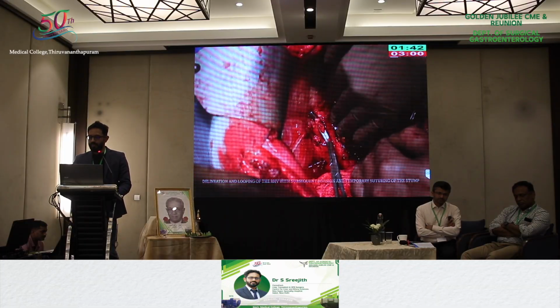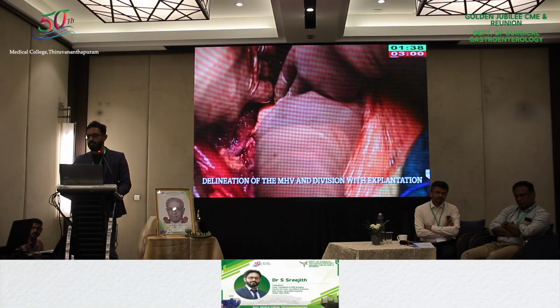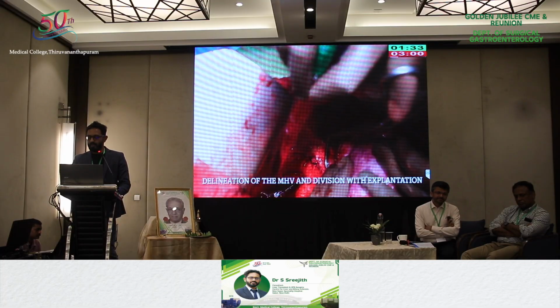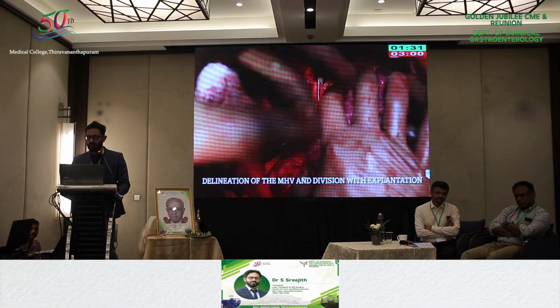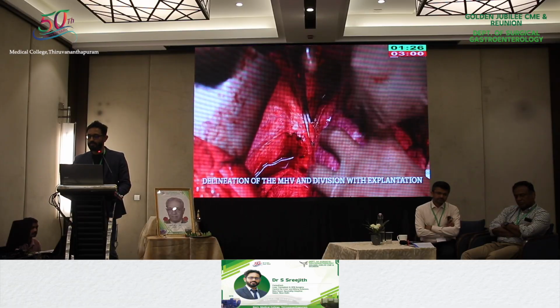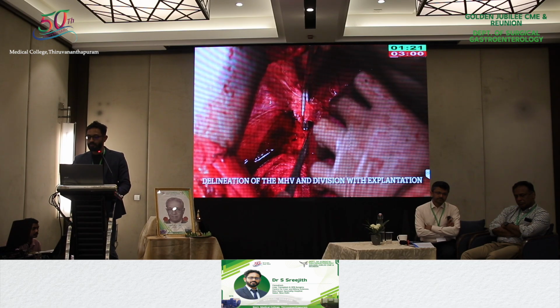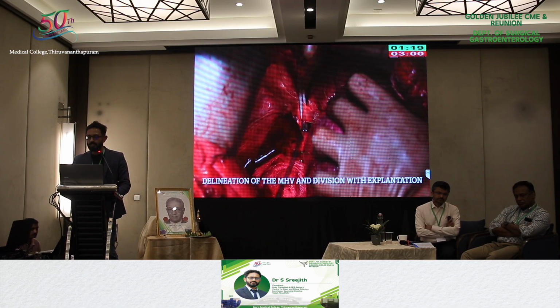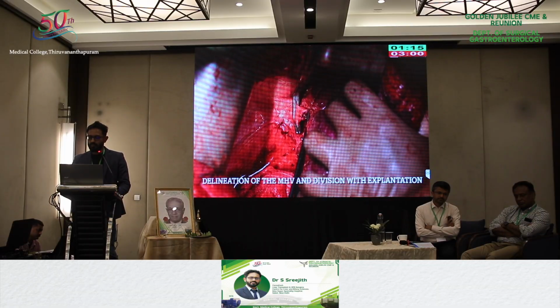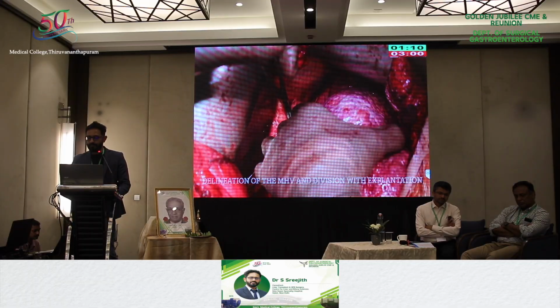After division of the right hepatic vein, the liver is just held by the MHV, and obviously the caudate part would be taken care of before that. Now it would be held only by the MHV-LHV complex. It's always better to get a good stump of MHV because in our unit we use the MHV-LHV complex for the new MHV reconstruction.